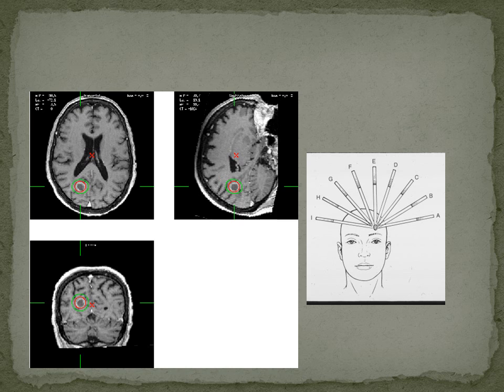And the way we look at this on the computer screens is by looking at various arcing planes. Each of these represents a plane going from the front of the patient to the back of the patient in parasagittal and transaxial planes. And you get these nice tight distributions with these nice tight gradients. Because we are very, very close to using a symmetric set about the patient's head, we tend to get round distributions. Not quite round. And you can see this is not quite round, but it's very, very close.